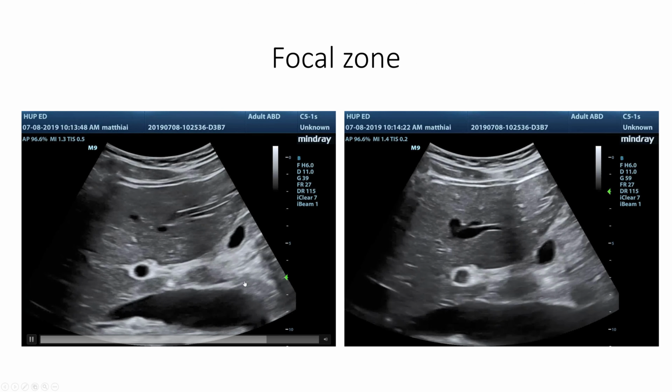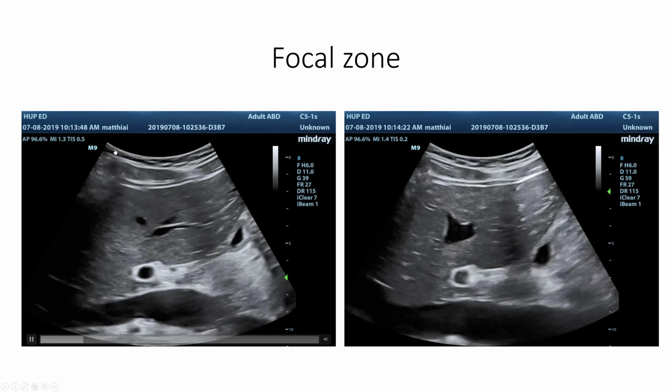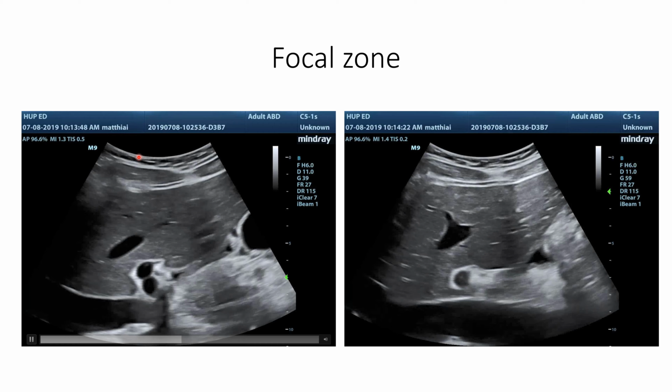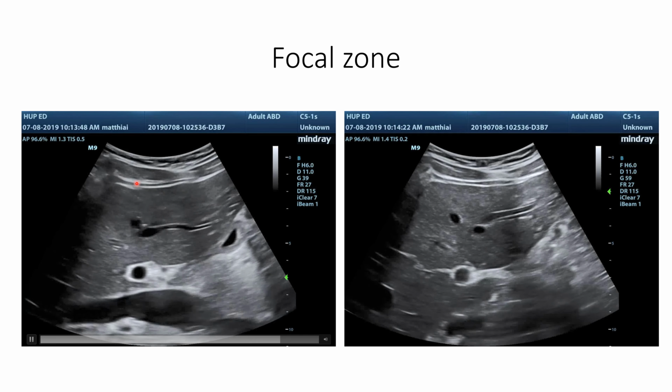The physics of what a focal zone does, I will just touch on extremely briefly here. I'll just mention it because I think it helps to remember what it is and bother to even adjust it.